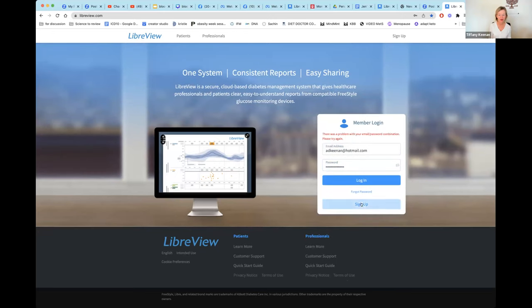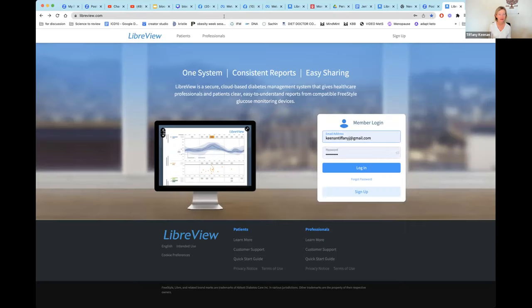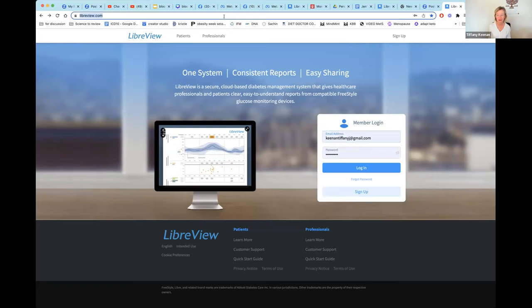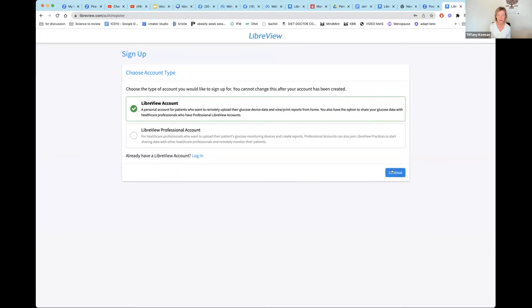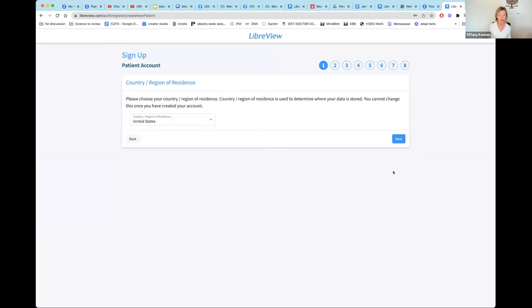I'm going to sign up to show you what you would do. Go to libreview.com and register — hit 'Sign Up'. The question is whether you want a LibreView account or a professional account. You're going to choose a LibreView account, since you just want this for yourself, then hit the Continue button.